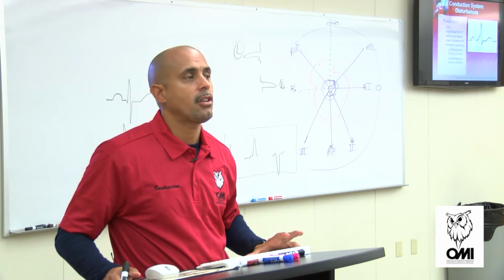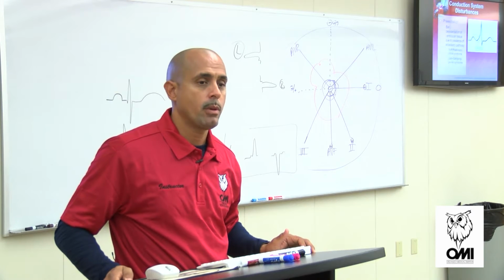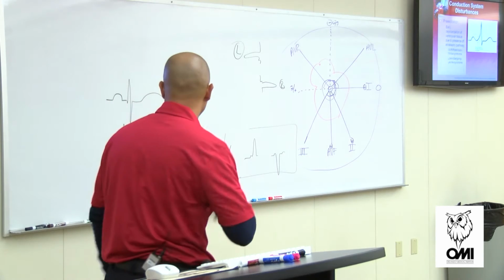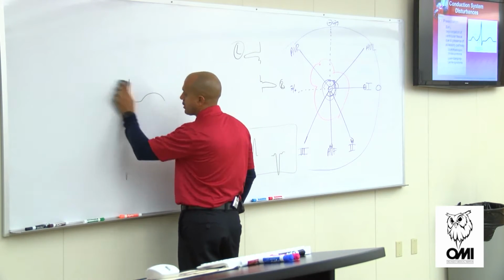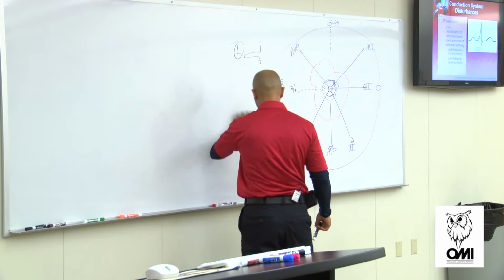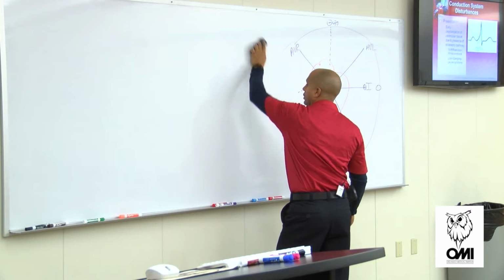So what's that disease called? WPW. WPW, Wolff-Parkinson-White. Okay? So what's going on with Wolff-Parkinson-White when we see this? When this happens, why is it depolarizing early? What's going on? How? Correct. And then you say, what is the biggest problem with WPW?